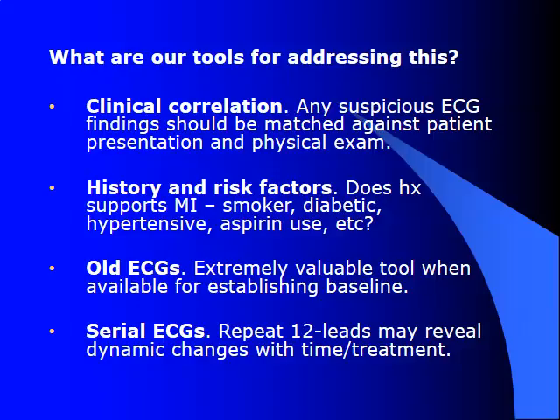A side note here, talking about our nitro administration. I don't know if I mentioned it whenever we were talking about when we do our 12 leads, but I did mention that it should be before nitro administration if possible. The reason is there have been several documented cases where an EMS crew has done a 12 lead. They had a chest pain patient. They gave their nitro, and then a couple minutes later they did their 12 lead. Well, they didn't see any ST elevation on it, so they transported their patient.